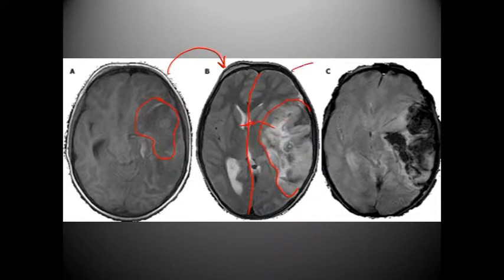And then follow-up evaluation demonstrates that we still do have that midline shift, but we have a transformation of the stroke.